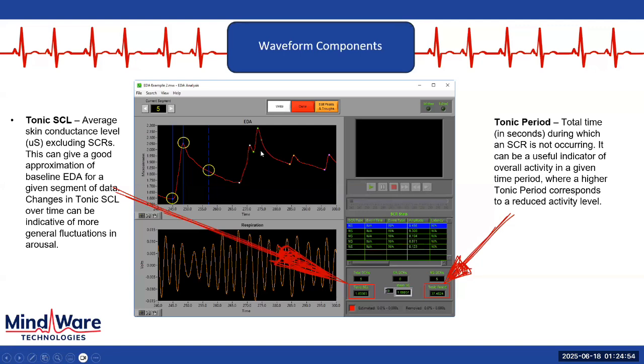This is perfectly normal. It is just something to be aware of in these cases because we might not have that period. So for this example here, as far as the phasic versus tonic period, we would actually say from this first trough all the way to this half recovery point here, this entire area was known as a phasic period. But anyways, going back to this idea here of the tonic level and period, this is just different things we can look at between the two.